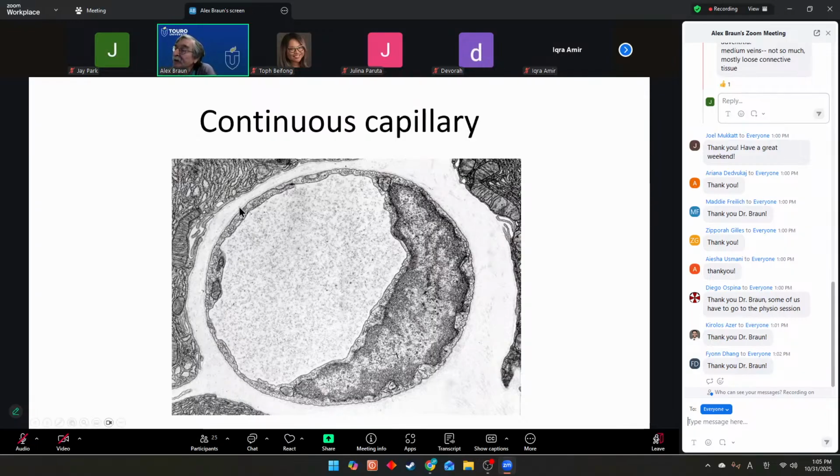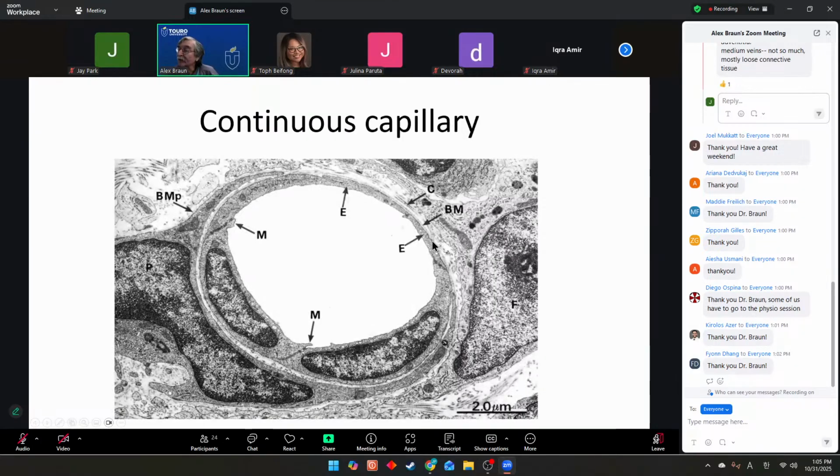Outside these endothelial cells, I see a rather pale gray line. That pale gray line is continuous. That is the basal lamina. In this particular picture, I don't see any pericytes, any outer cell on the outside of the endothelial cell. Here I see an endothelial tube, which is the continuous capillary, but on the outside I see another cell embracing the capillary. You see the cell here embraces the outside of the capillary. It sends processes, in other words, embracing the outside of the capillary. That's a pericyte.